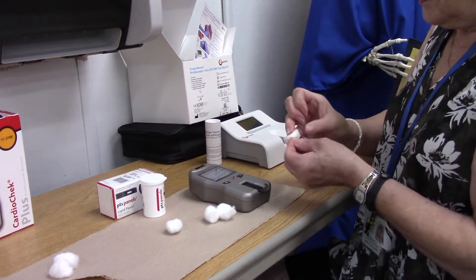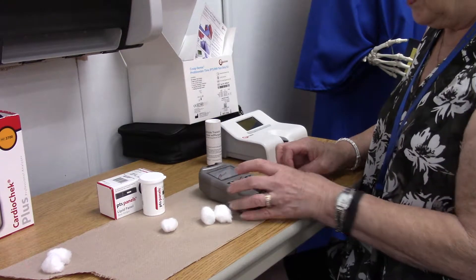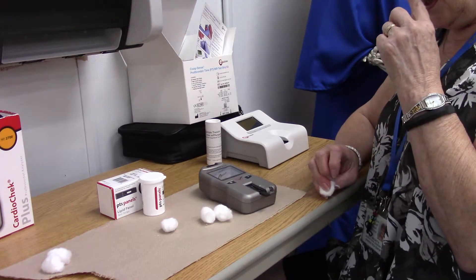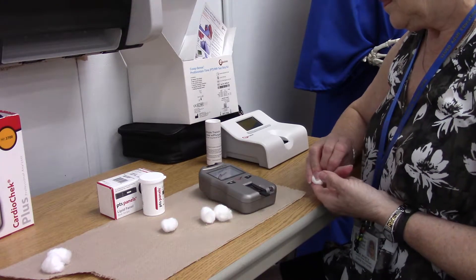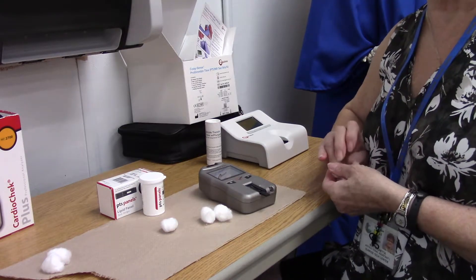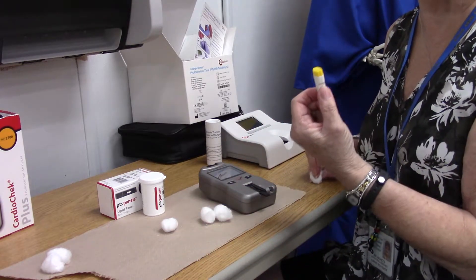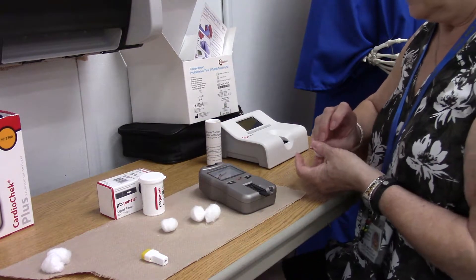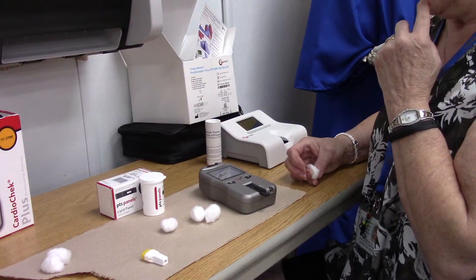Once you get enough blood, the machine gives you a little heart check indicator. Keep dropping blood until you see the 'testing' sign, which means it's testing. While it's testing, make sure your patient is not bleeding — put a band-aid on them. We're using a blade, just like before, which creates a larger puncture so they will bleed. The machine says 'testing,' so don't get impatient — it takes a little while.